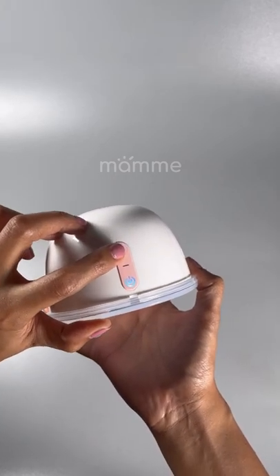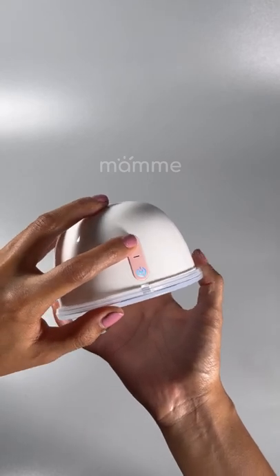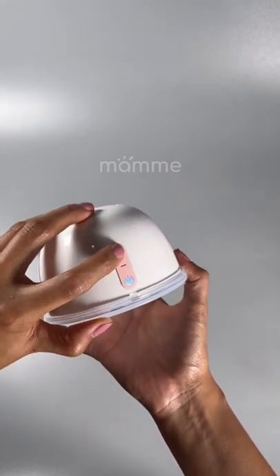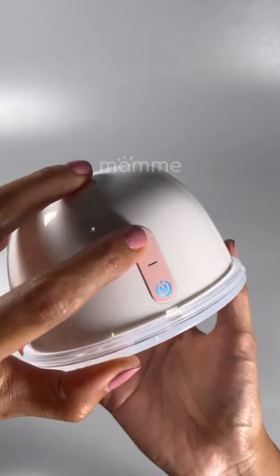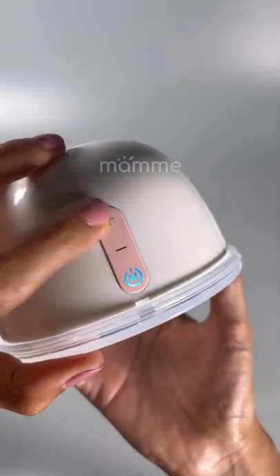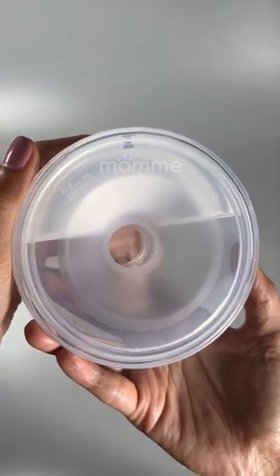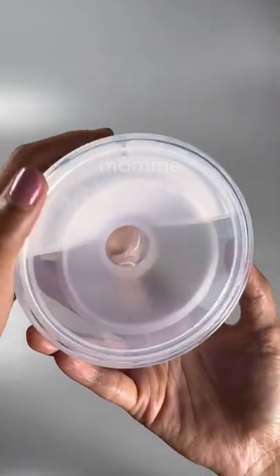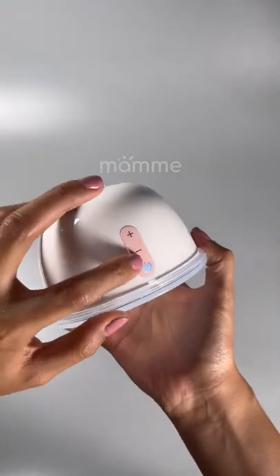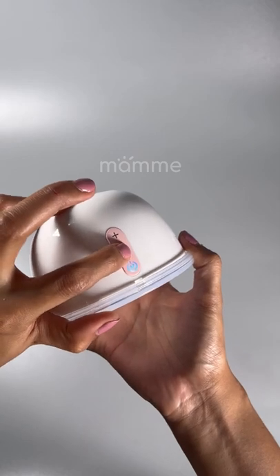Let's go to the 9, to the highest level. Malalaman natin na highest level ka na kung magblink siya. Ayan, naririnig niyo na yung motor. Ayan, nasa highest level na. It looks like that. Okay? Alright. Same thing then, how to decrease the suction. Kailangan lang i-press yung minus sign.